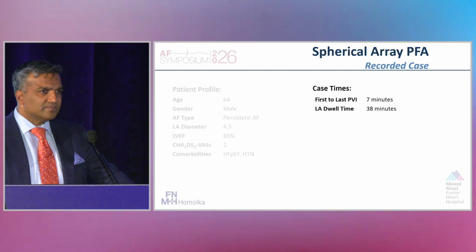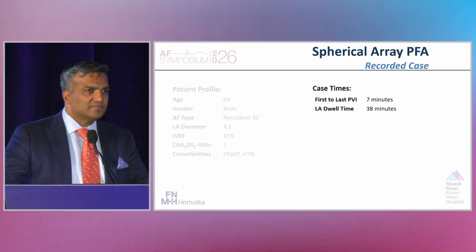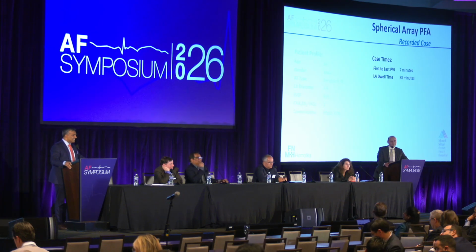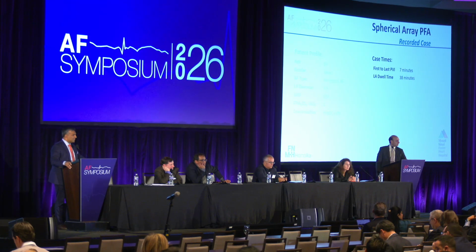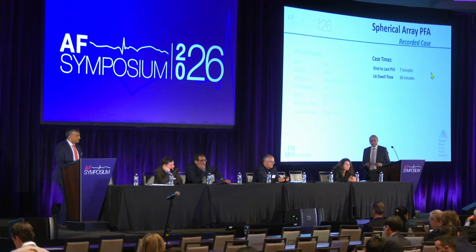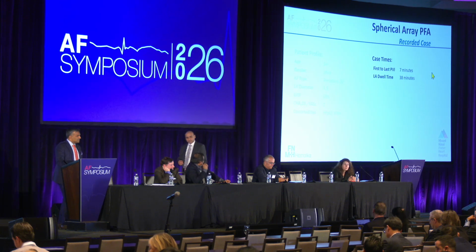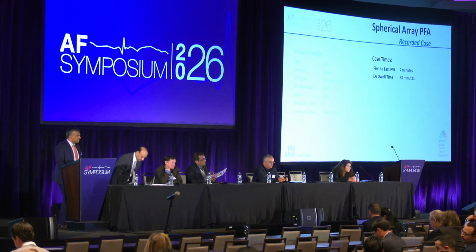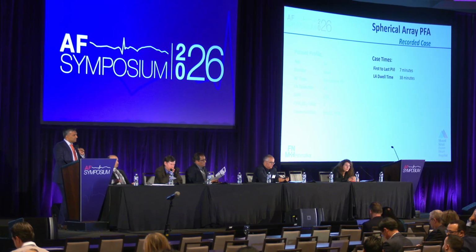I want to add something funny because, remember, yesterday we discussed with Boris. Boris is somewhere here. Poor Germany, they have no ICE, right? Because they have no money for ICE. And it's interesting that the globe, I believe, we can use even without ICE. Because the contact information is so good, you have ideal positioning of the PV and everything. You can just visualize by the sphere, the globe itself. So this is some advantage for poor Germany.